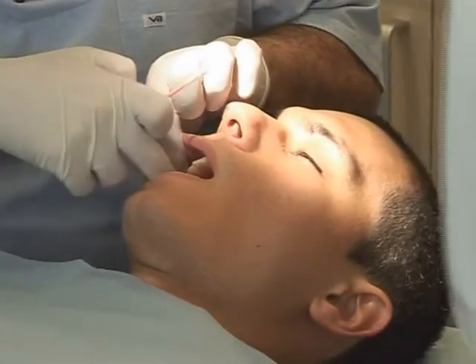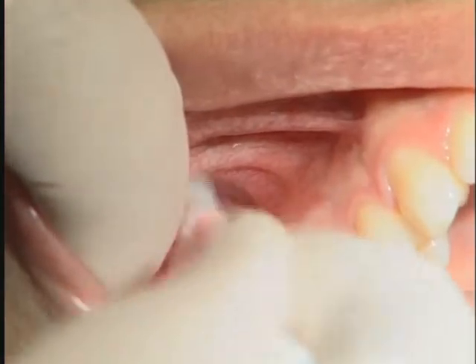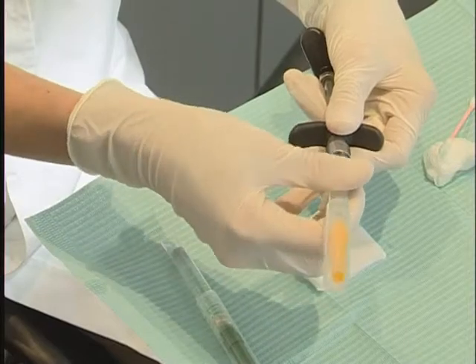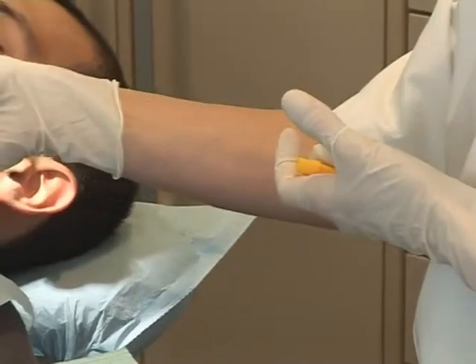Ask the patient to slightly open their mouth and then move the lower jaw on the side to be injected so that the area can be seen clearly and the mucobuccal fold accessed. Perforate the mucous membrane facing the mesial buccal root of the second molar.